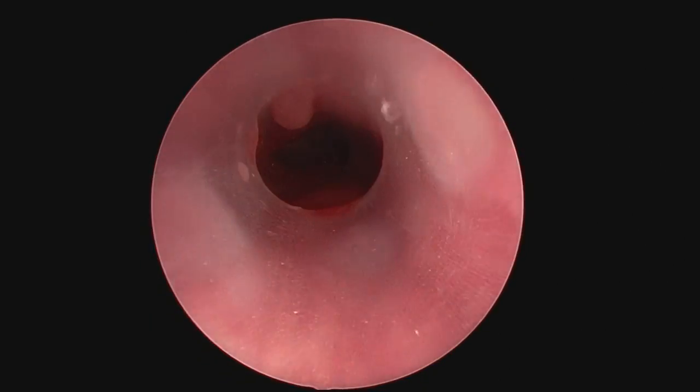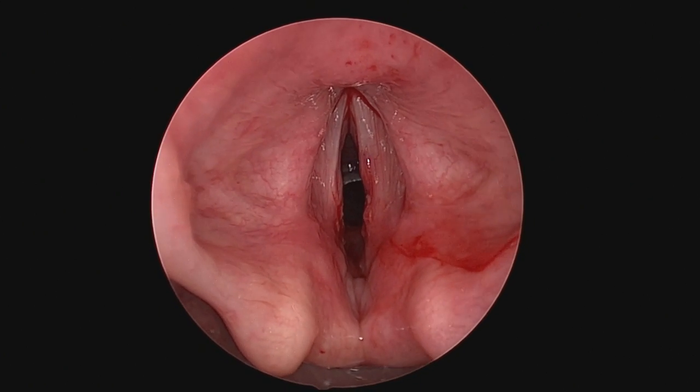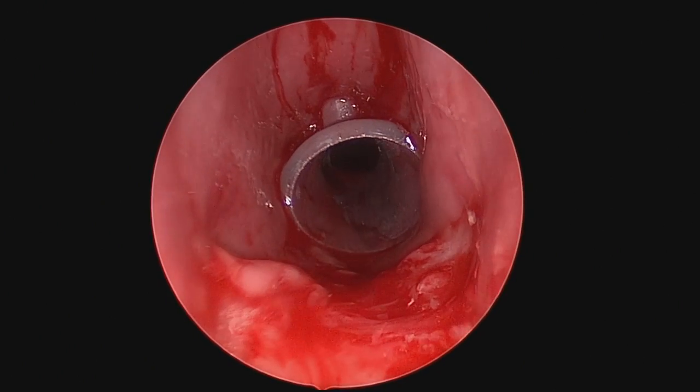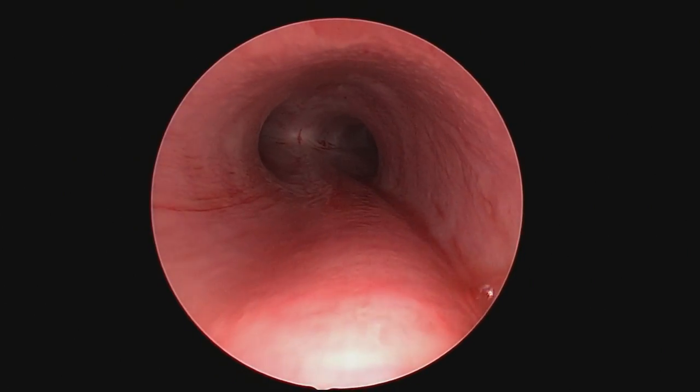Once you get it in position, make sure everything's okay. This is the end result. Vocal cords look pretty good. The Dumont stent could be a little better positioned, but I was happy — the enemy of good is better. We'll see how the patient does, and I'll give you a follow-up when I can. Thanks.